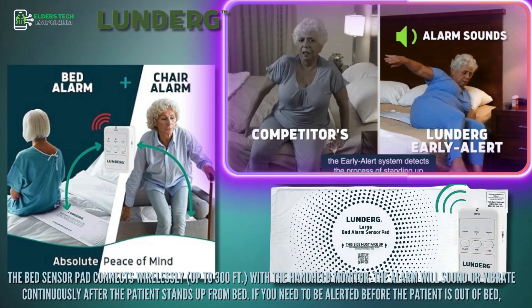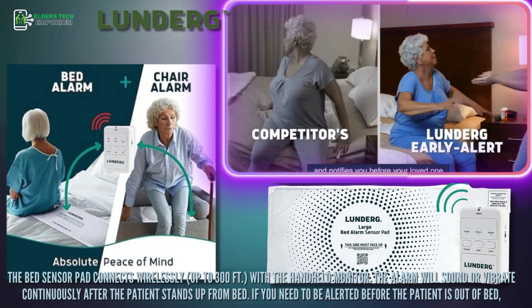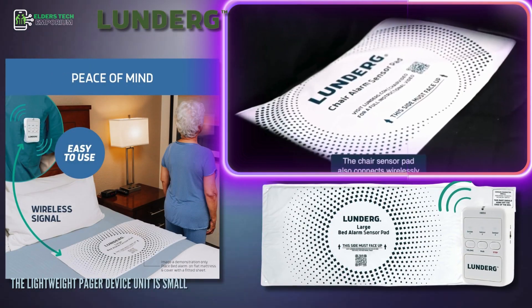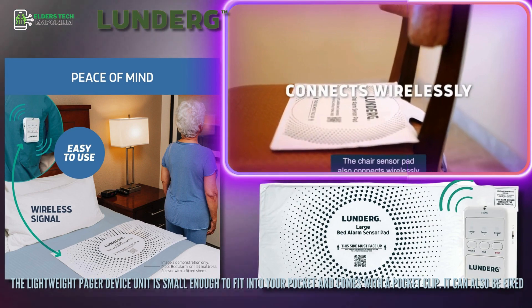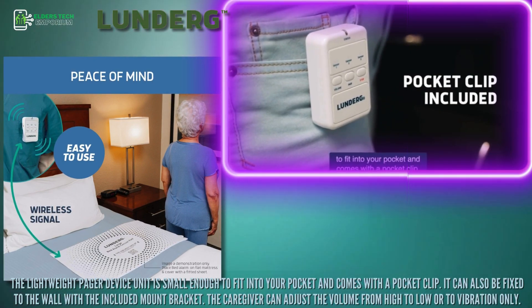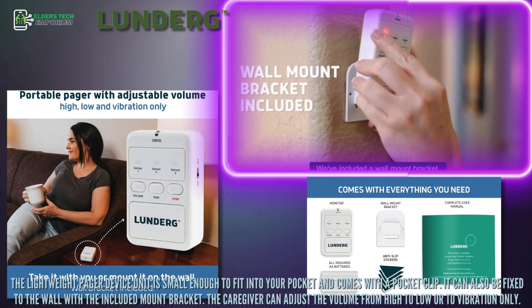If you need to be alerted before the patient is out of bed, the lightweight pager device unit is small enough to fit into your pocket and comes with a pocket clip. It can also be fixed to the wall with the included mount bracket. The caregiver can adjust the volume from high to low or to vibration only.